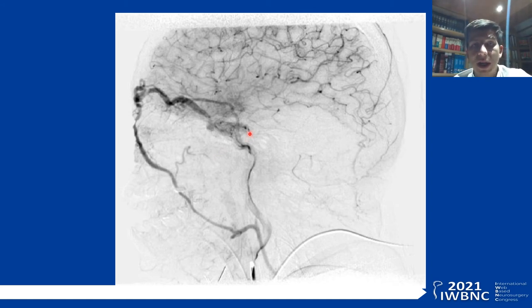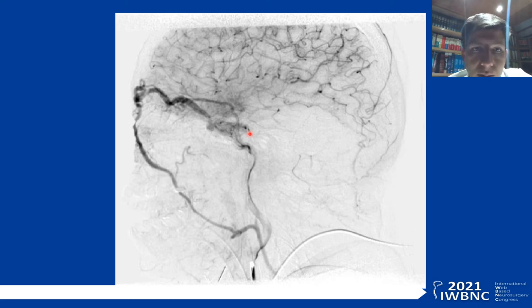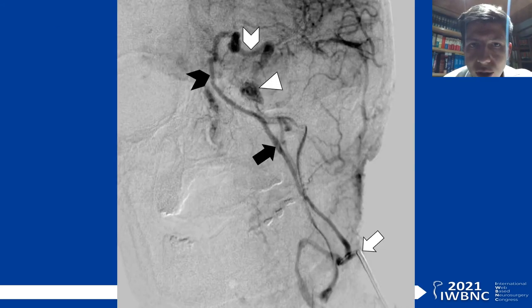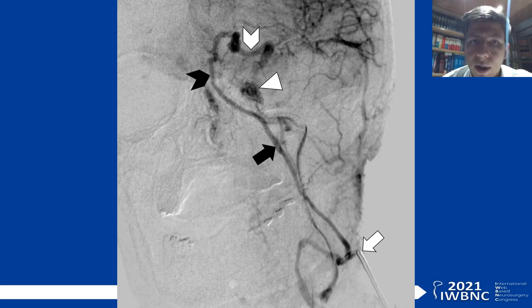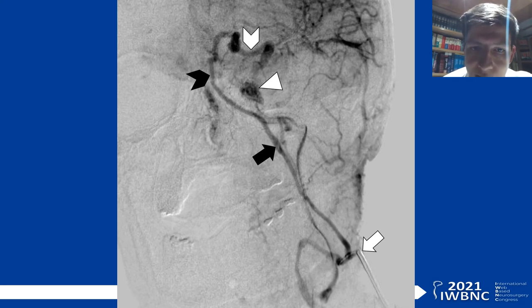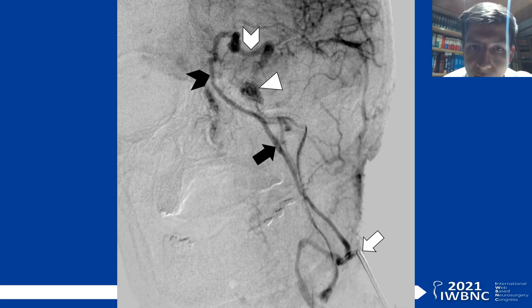For that reason, we decided to take the patient for a second treatment with transvenous embolization using a multimodal approach for the indirect carotid cavernous fistula. In the transvenous embolization, shown here in a lateral projection road mapping, a guiding catheter was advanced through the brachiocephalic vein and the external jugular vein. The microcatheter was advanced to the left posterior and anterior branches of the retromandibular vein, then through the facial vein shown by the black arrow at the angular vein shown at a more superior level, and into the superior ophthalmic vein in relation to the cavernous sinus.